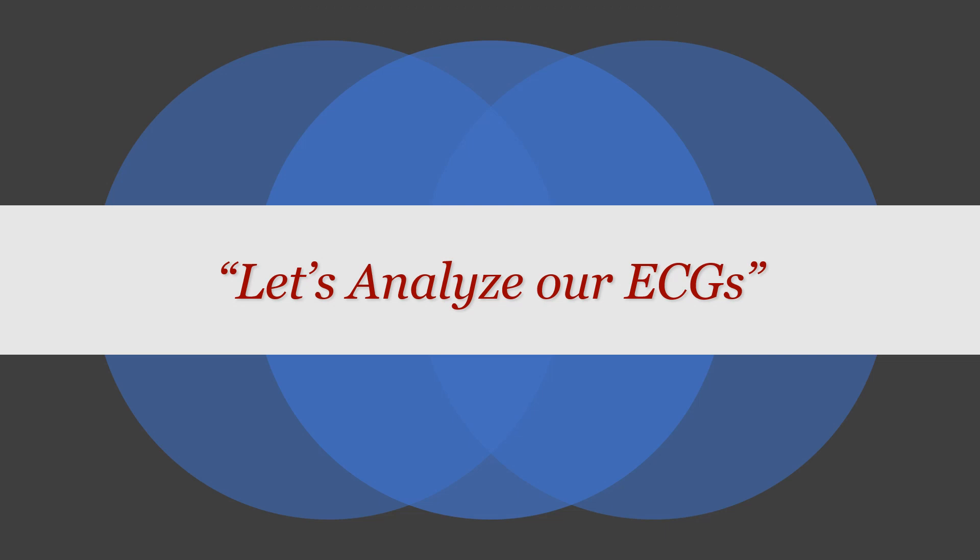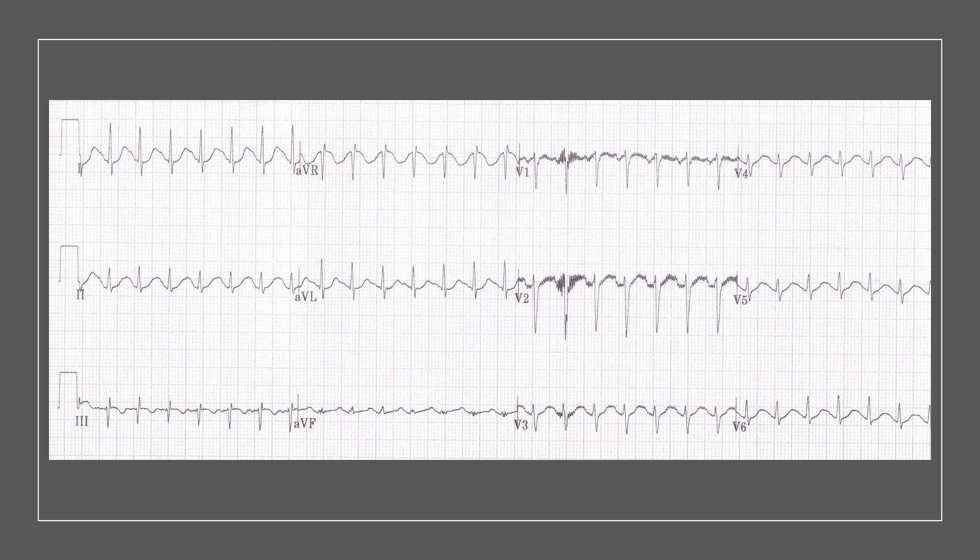Let's analyze our ECG following this approach. Checking the first three questions about the complex — rate, rhythm, and width — the rate is clearly fast, about 170, so we've got tachycardia. The rhythm looks very regular. And the width: this is a narrow complex. So we have a narrow complex regular tachycardia.